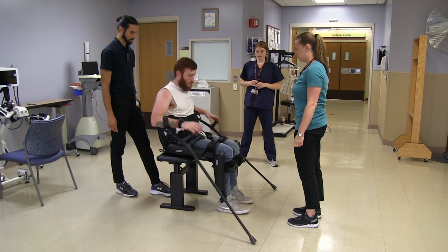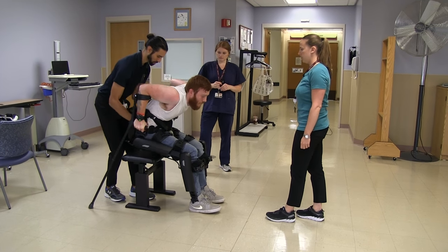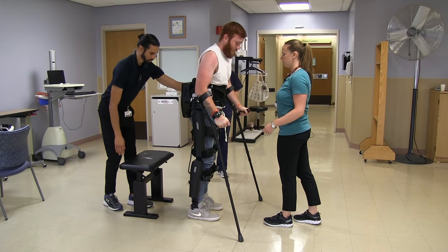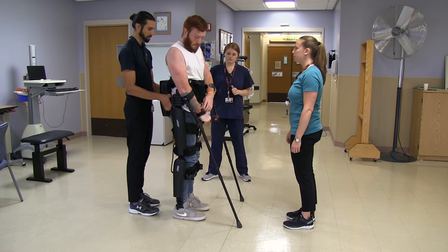Keith is now standing. The therapist encourages him to keep coming forward and bring the crutches forward. Keith says he feels good, and the therapist says let's go right into walking — whenever you're ready. Going well.